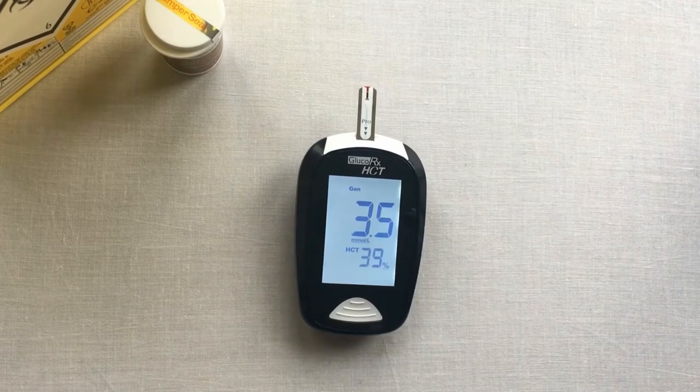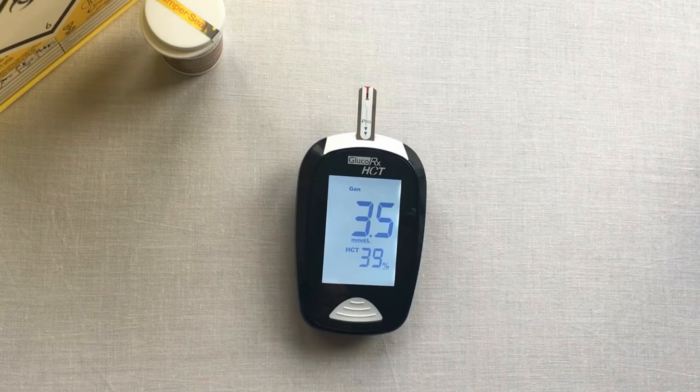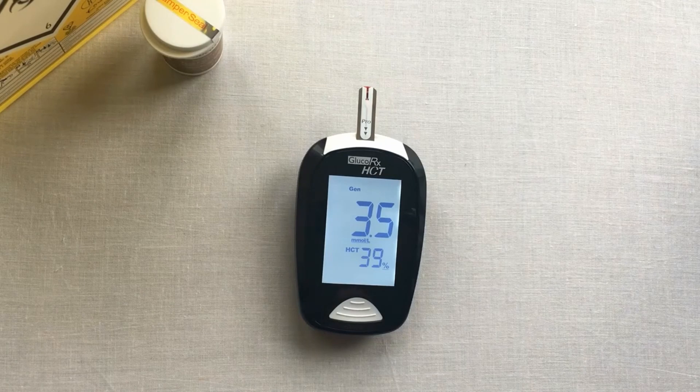Your meter will begin to count down from five to zero. Here your result is displayed on the screen alongside the hematocrit reading.